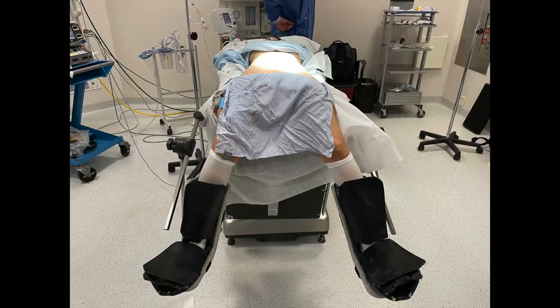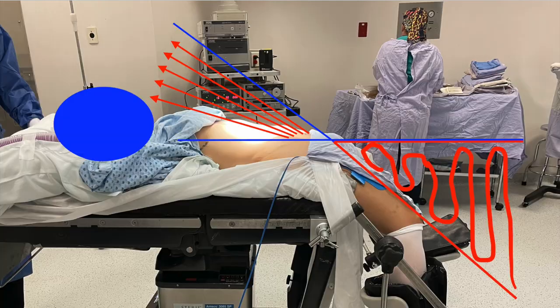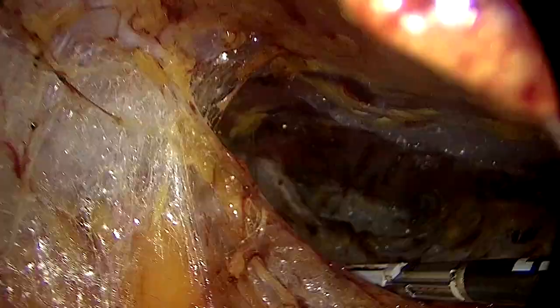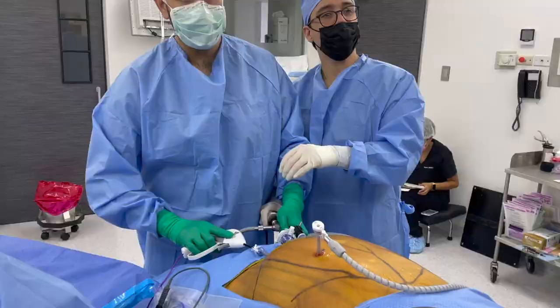This is the position I give to the patients, and later in the case I'm going to tell you why this is important — you need to leave this space for you to work, because that is the angle in which your clamps are going to travel throughout the case. Once you are situated in the middle of the patient's legs, you are working bottoms up. My first goal is to clear and further develop the retrorectus space that I initially came into.